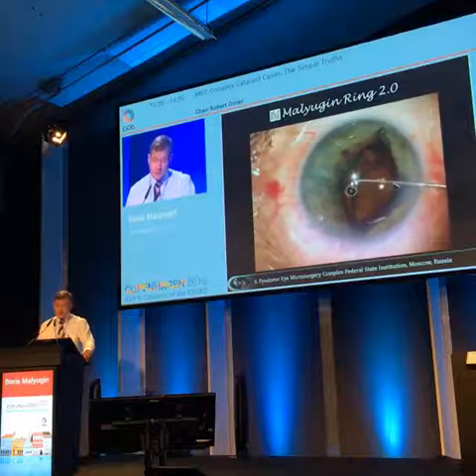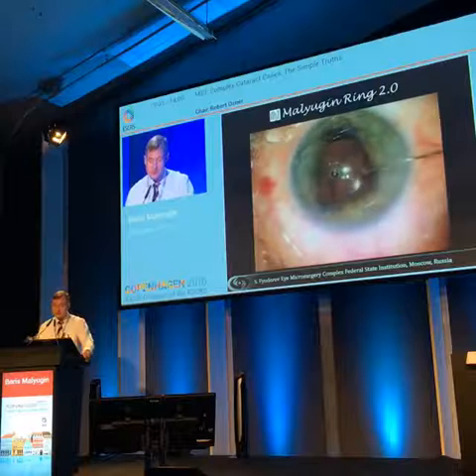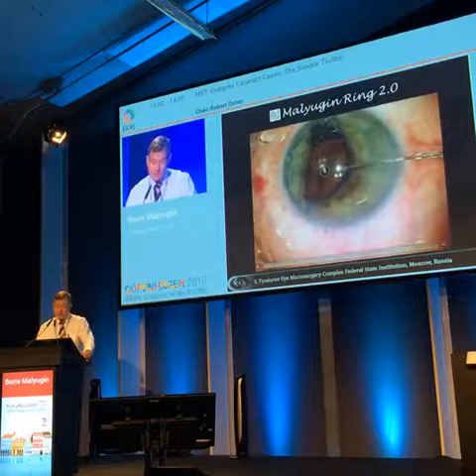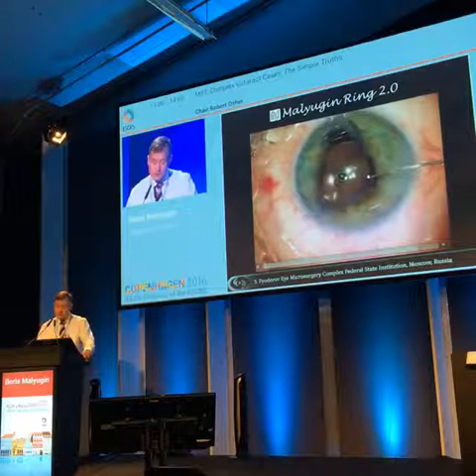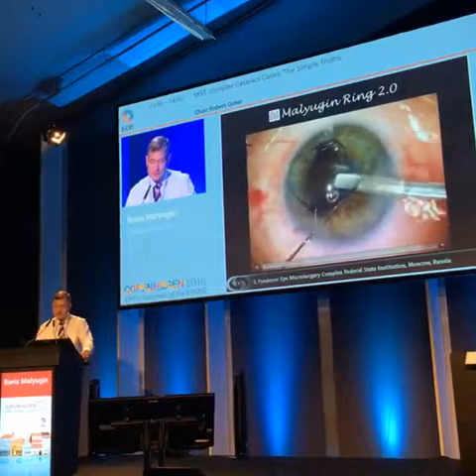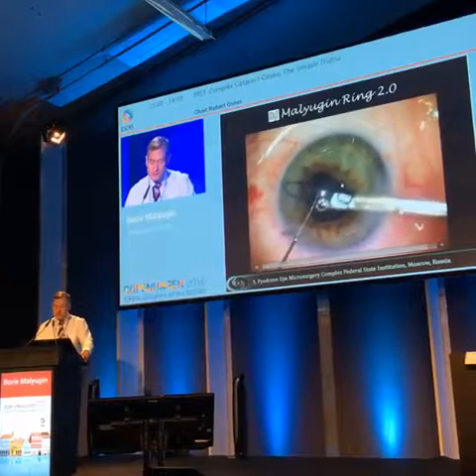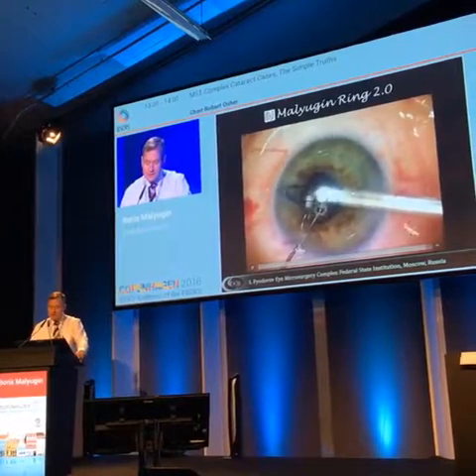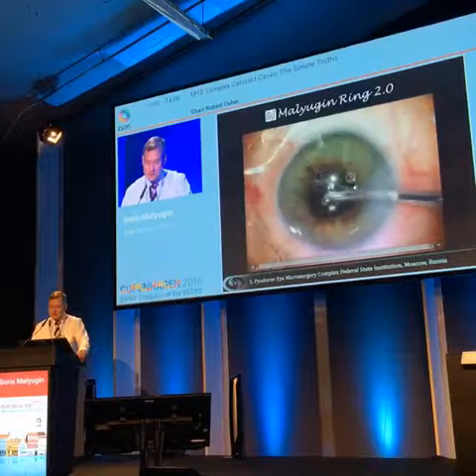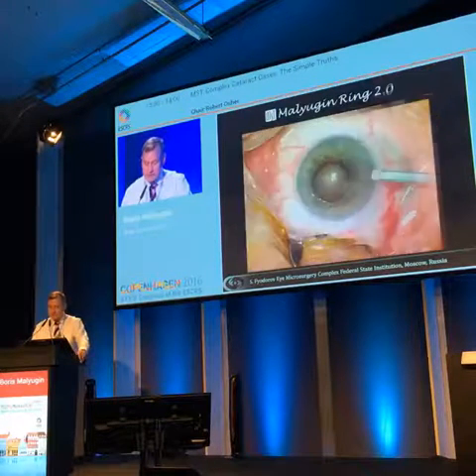And similar to what was shown by Bobby, I like to disengage the distal scroll first, followed by the proximal scroll. And I usually do not disengage the lateral scroll because I don't think it is really necessary, because when you are retracting the ring, it goes in and disengages from the iris quite easily. And this is the end of this case.